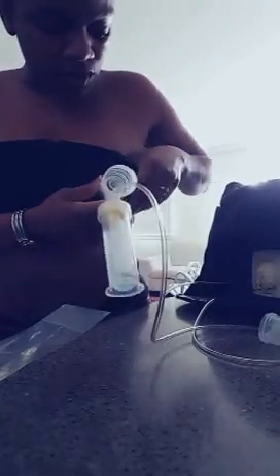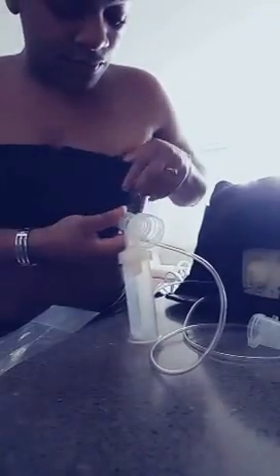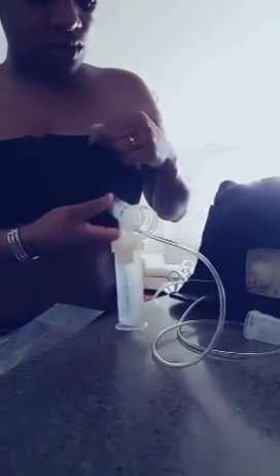Make sure that your nipple fits in comfortably and correctly. Make sure the nipple is not stuck to the top of the breast shield. Make sure that it's just facing straight ahead and ready to pump. So you see how simple and easy that is? And then we're going to do the right side.